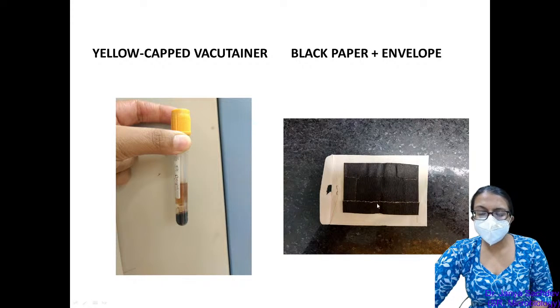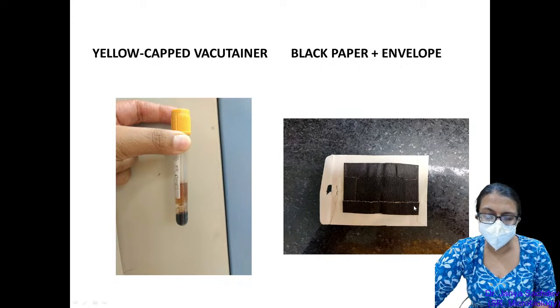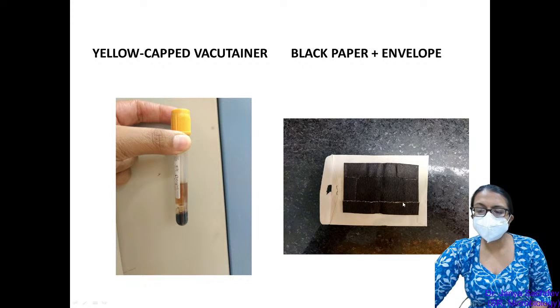So when we're mainly looking for dermatophytes, we don't want yeasts or bacterial commensals to be growing from skin and nails. The problem is that dermatophytes, or indeed many of the other molds like I mentioned, Fusarium or Aspergillus or Neoscytalidium, which cause skin and nail infections or hair infections, these are very slow growing. So they take weeks to grow. So if the commensal flora are allowed to overgrow them, then we will never be able to isolate the pathogens in culture. So this paper basically is hygroscopic.